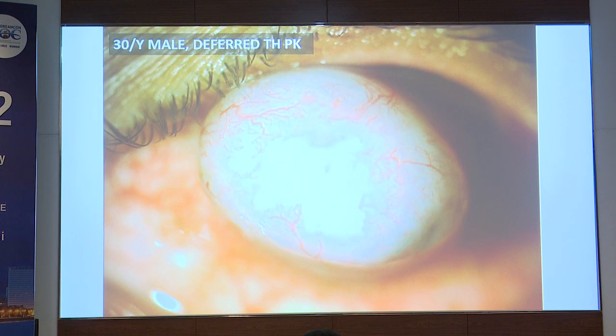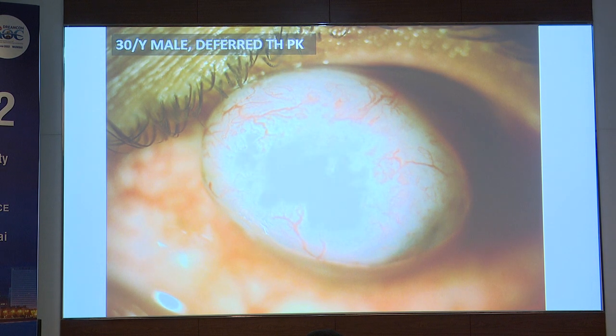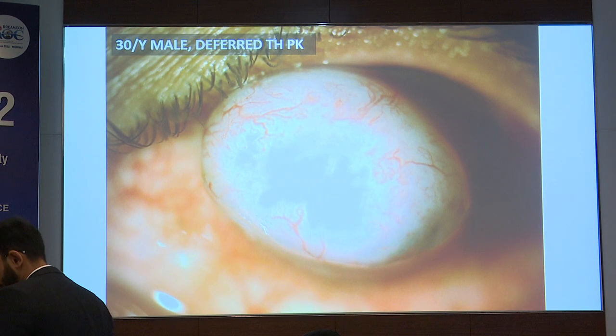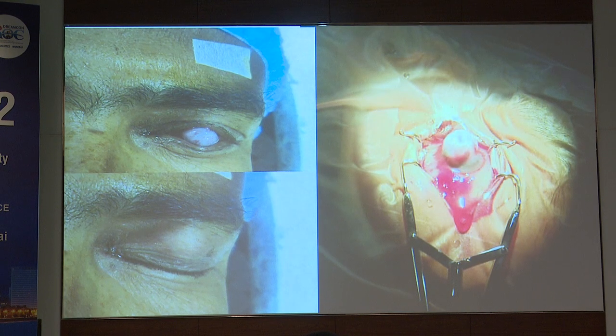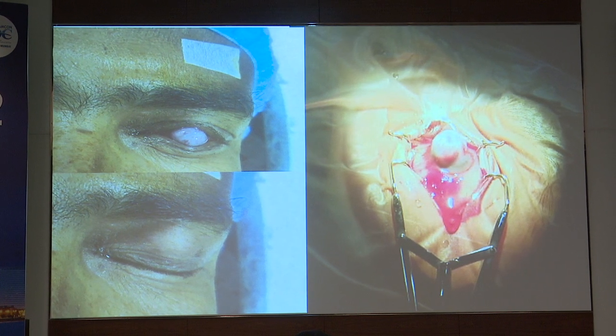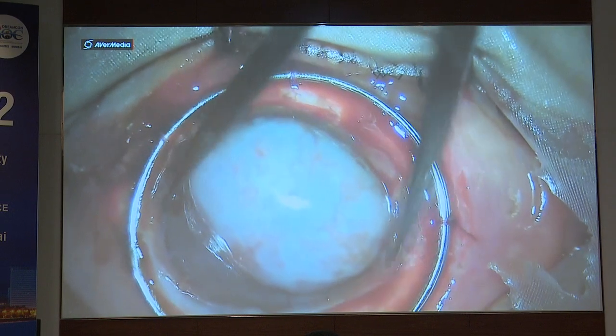So this is a case of a 30-year-old male who deferred therapeutic PK advised by me for 7 months and then presented back with a large anterior staphyloma. This staphyloma was hindering the closure of lids, was cosmetically very disturbing to the patient, and if you can see, it was quite bulging out. So I planned a tectonic graft.